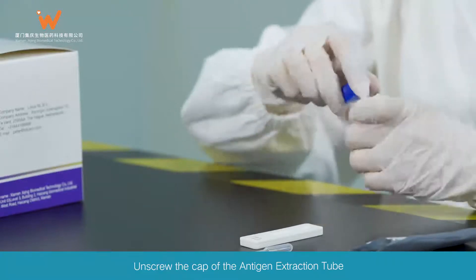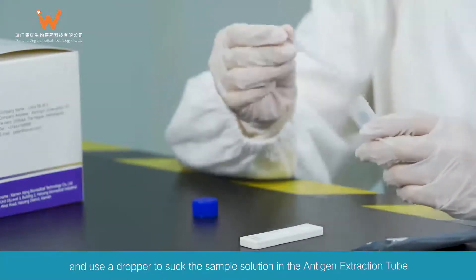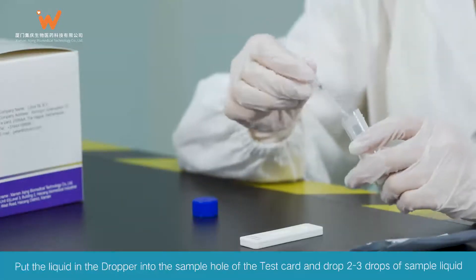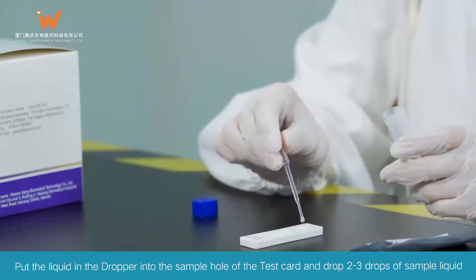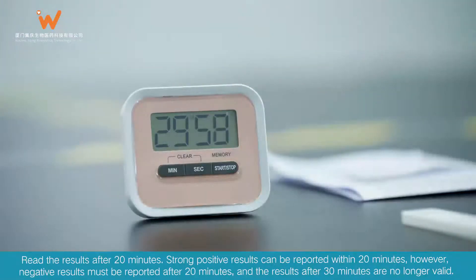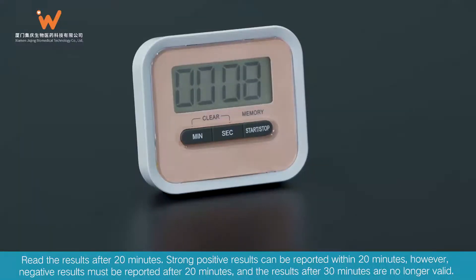Unscrew the cap of the antigen extraction tube and use a dropper to suck the sample solution from the antigen extraction tube. Put the liquid from the dropper into the sample hole of the test card and drop 2 to 3 drops of sample liquid. Read the results after 20 minutes. Strong positive results can be reported within 20 minutes; however, negative results must be reported after 20 minutes, and results after 30 minutes are no longer valid.